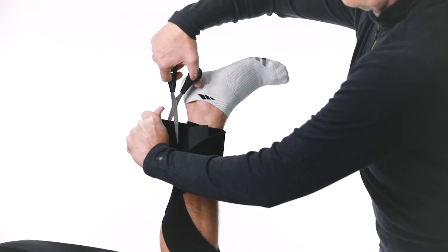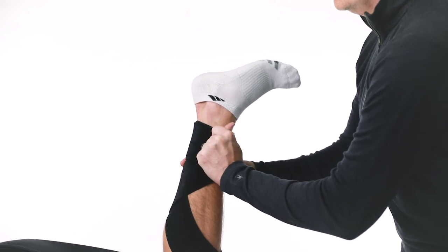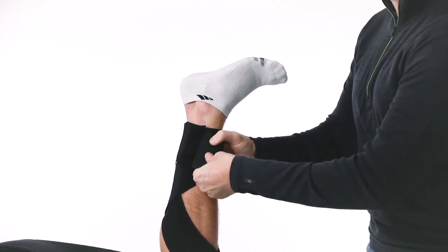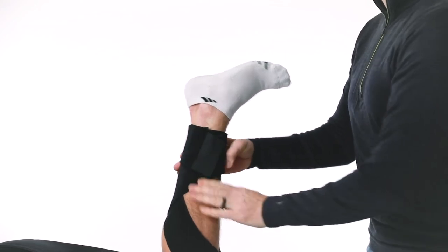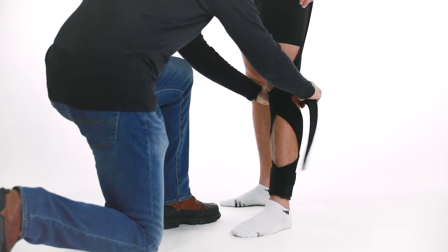To prevent migration, secure straps A and B below the kneecap.